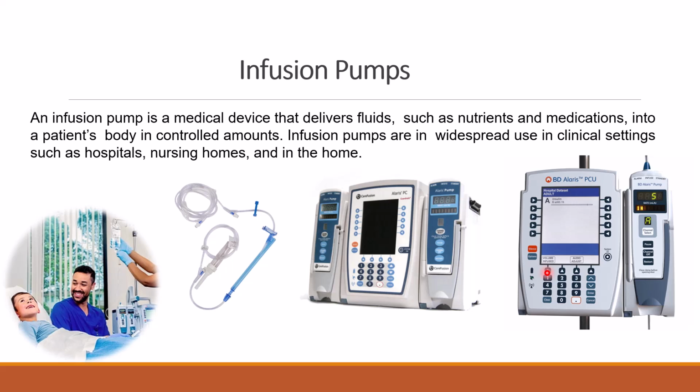An infusion pump is a medical device that delivers fluids such as nutrients and medications into a patient's body in a controlled amount. Infusion pumps are in widespread use in clinical settings such as hospitals, nursing homes, and in homes also. We have medications. We have, for example, fluids we need to deliver to the patients in a very controlled amount and in a very controlled time. So we need this device.